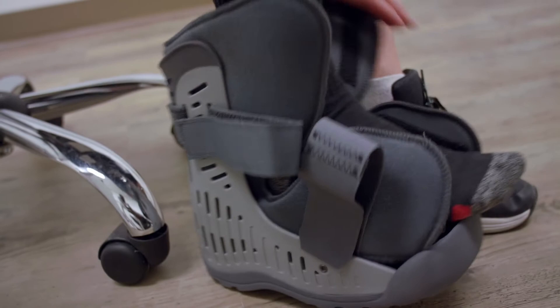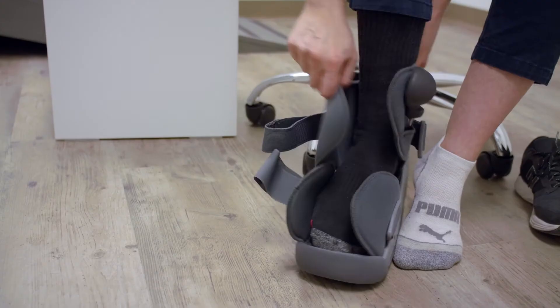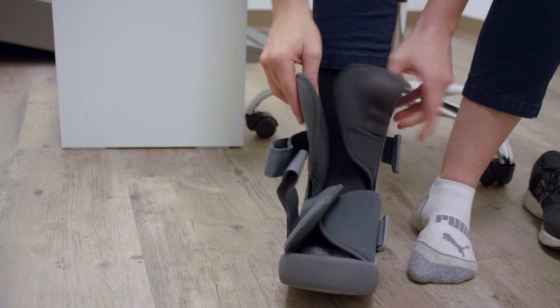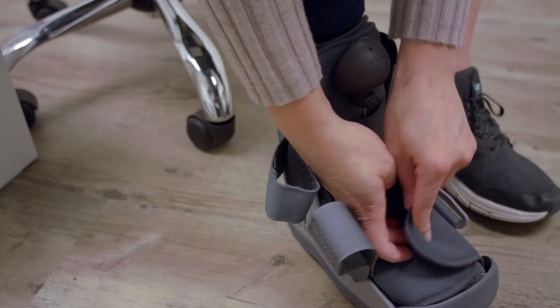Go down to the ground and put your foot in, heel right to the back. Always make sure you have a high pair of socks — it's easier to change your socks versus cleaning this. But the whole liner does come out and you can hand wash it and air dry.